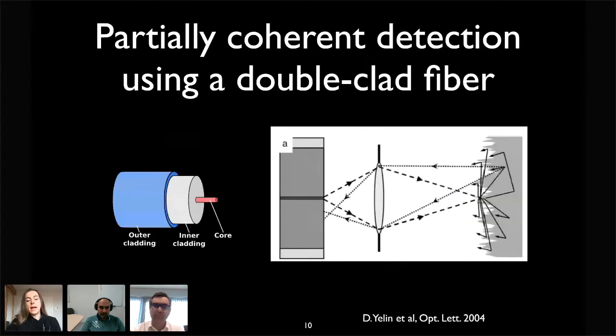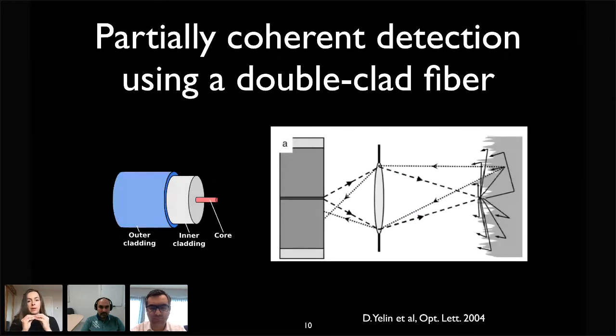But we also looked at the fiber optics. The fiber optics, as I said, is what brings the laser, the light, inside the body. So you go from the laser, you bring the light through the body, and then light will be reflected or backscattered by your sample and collected by the fiber.